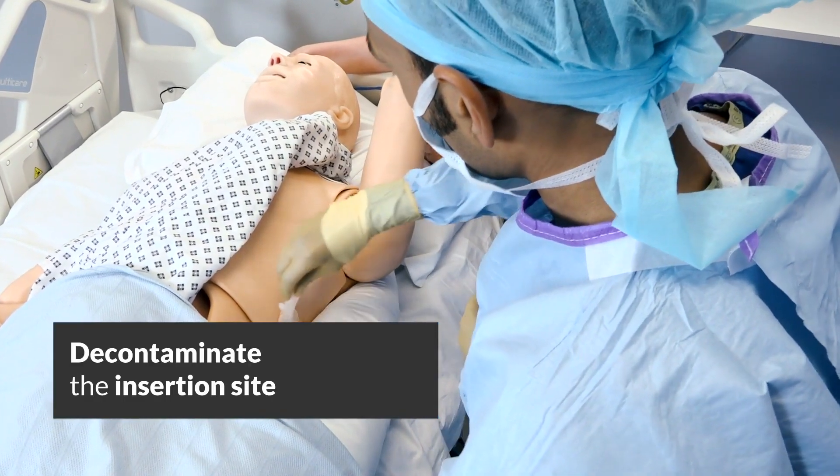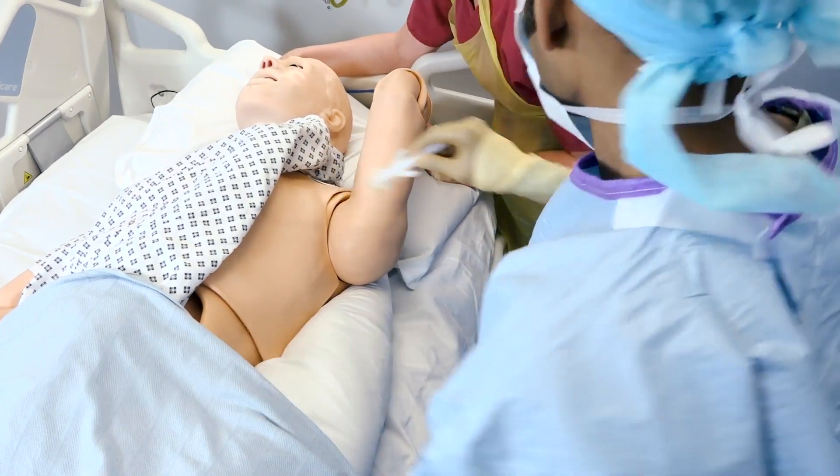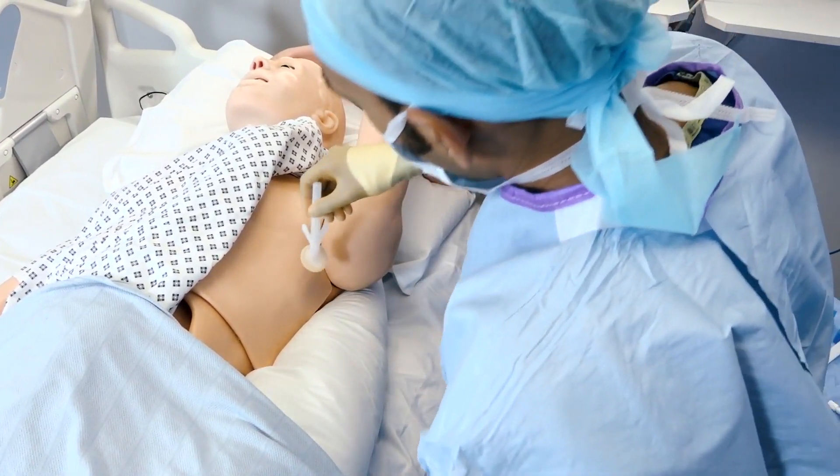Decontaminate the patient's skin at the chest drain insertion site, as per your local skin decontamination policy.